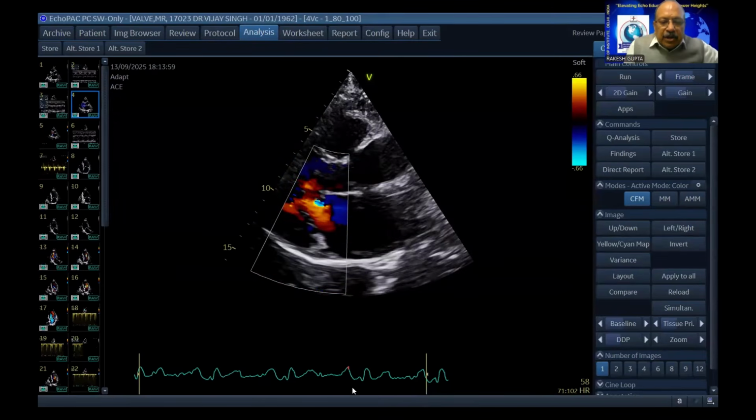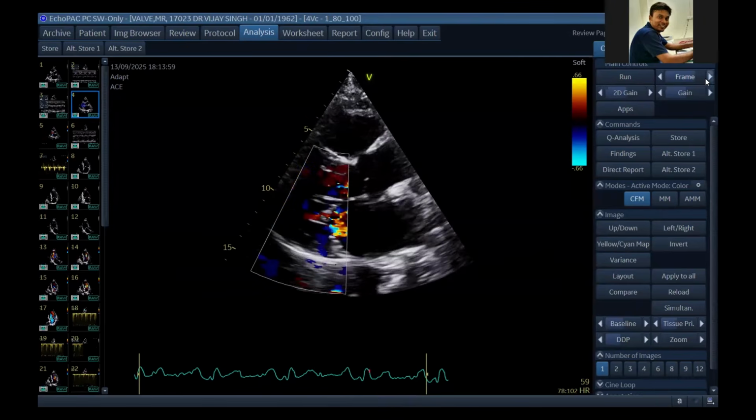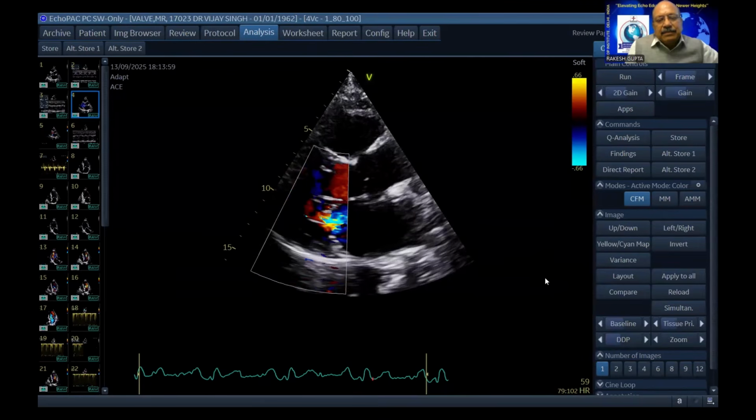So this is the beginning of a QRS complex over here. So this is at the end of the T wave. Let me show you from where it's originating now. So is it systole or diastole? It's diastole. Now this is systole. This is the beginning of the QRS complex. Yes, sir. Correct. A wide QRS complex is there. So this is almost in mid systole.